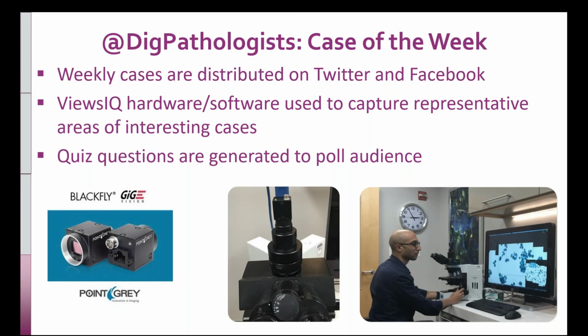So what did we do at UPMC? We posted interesting educational cases on a weekly basis. These are all de-identified clinical information, and we collected data for 5 months. These cases were scanned using the Panoptiq system and uploaded to their web portal, where these cases were shared on social media, namely Facebook and Twitter pages, and analytics were used to monitor user traffic. Quiz questions were also generated to poll the audience and provide further feedback on the diagnosis.